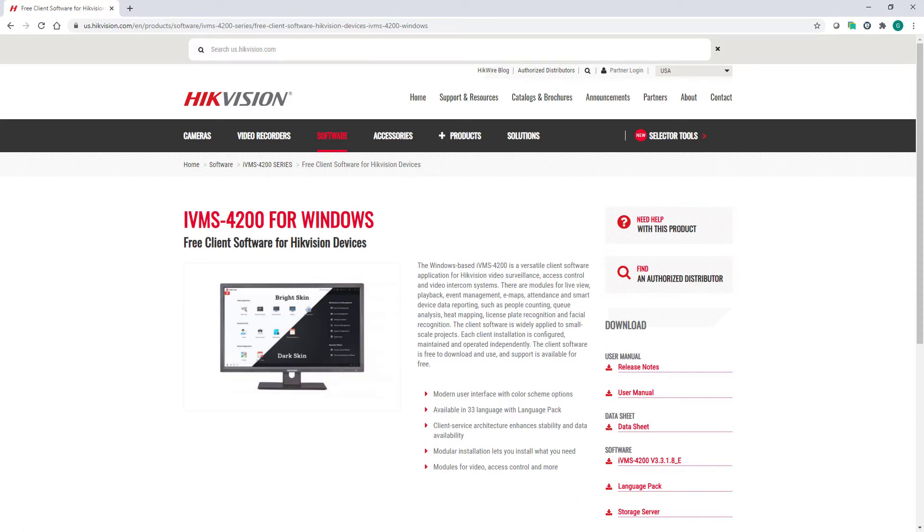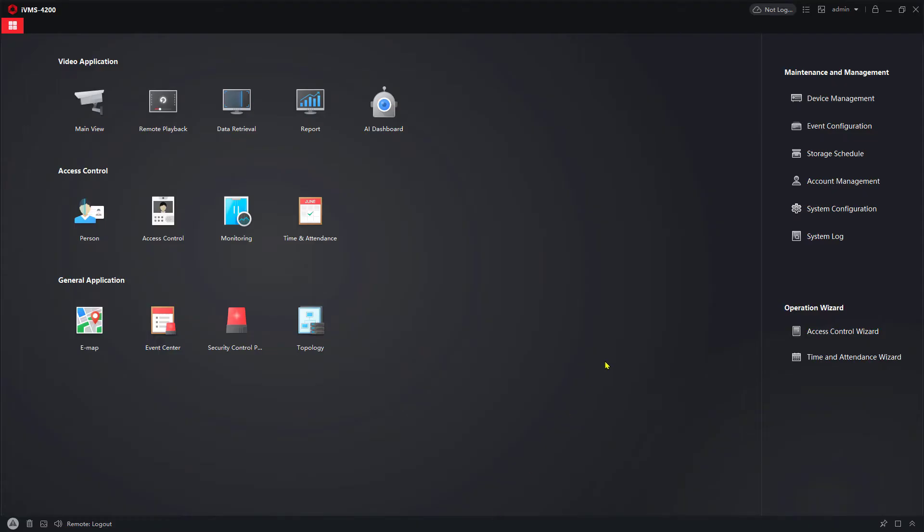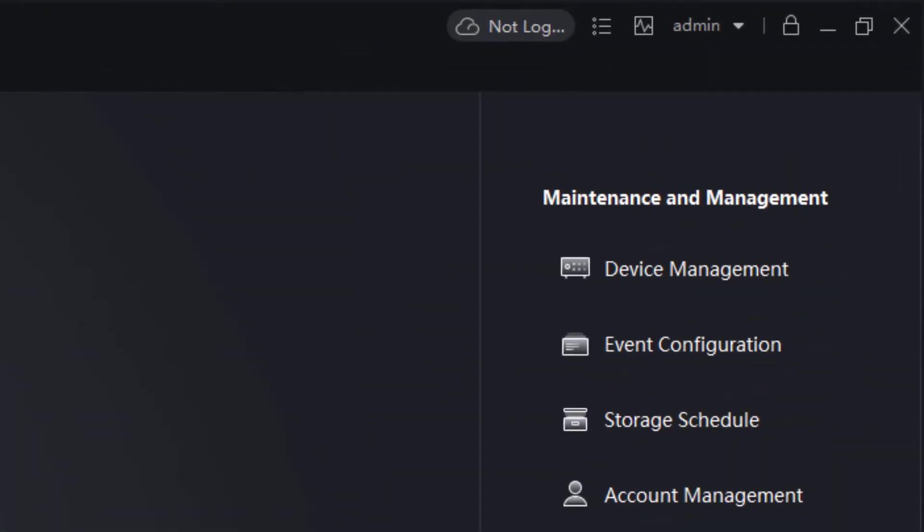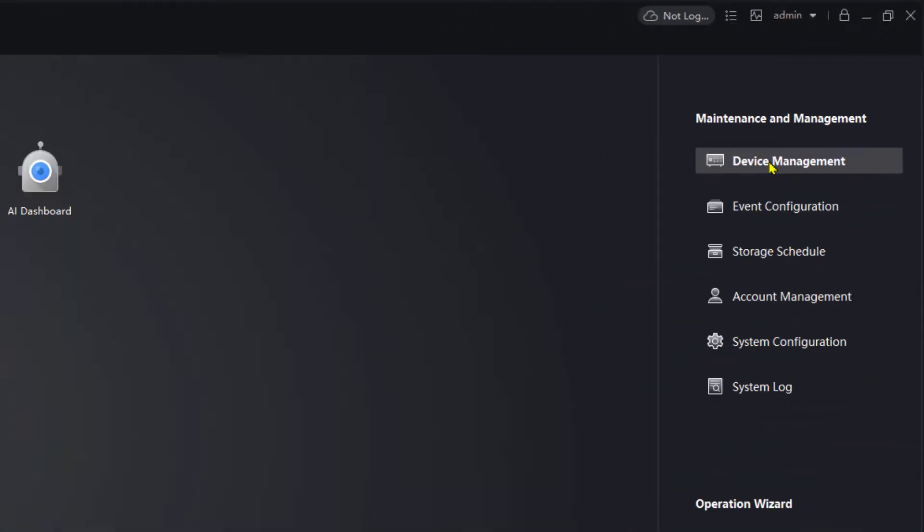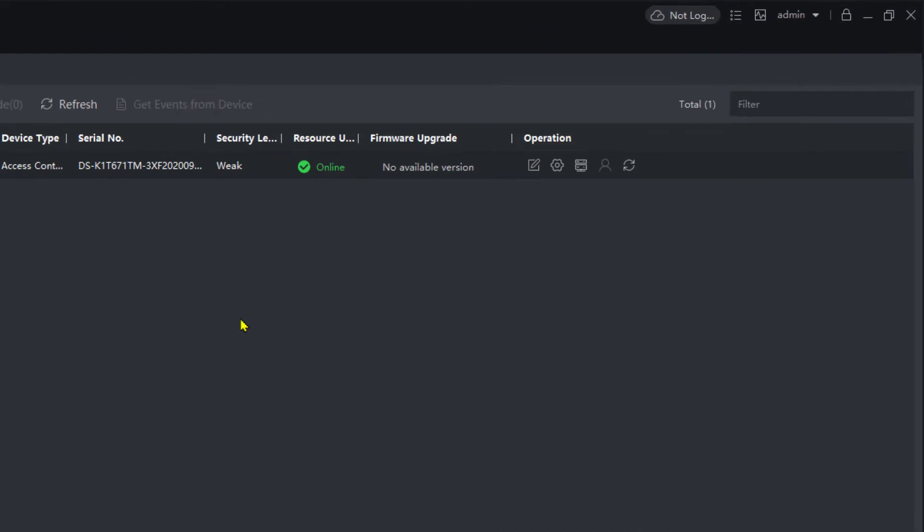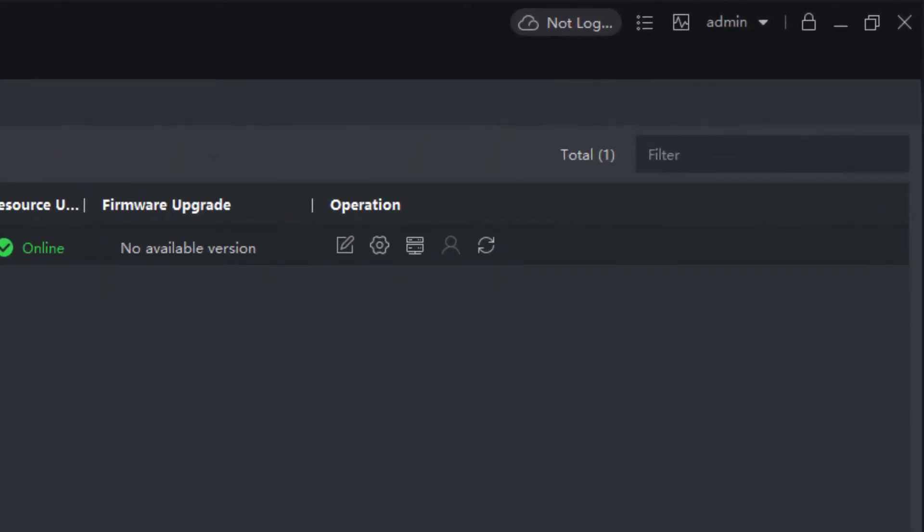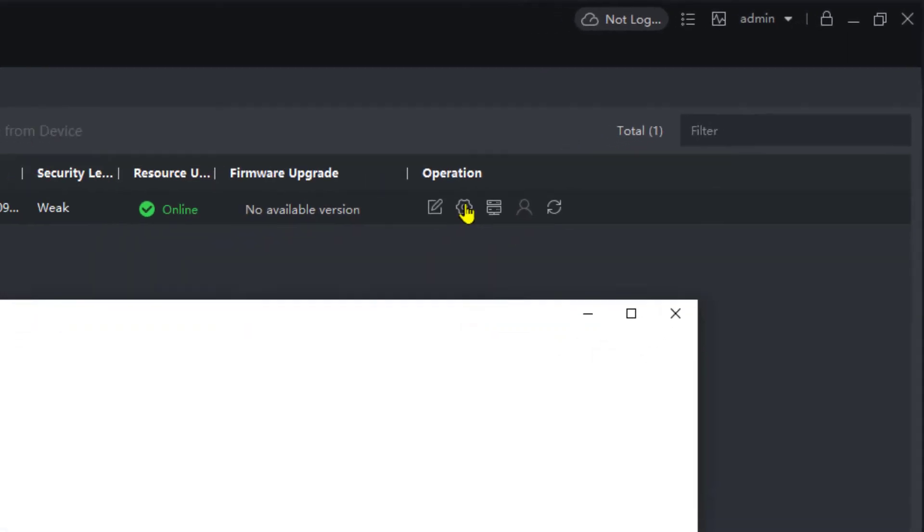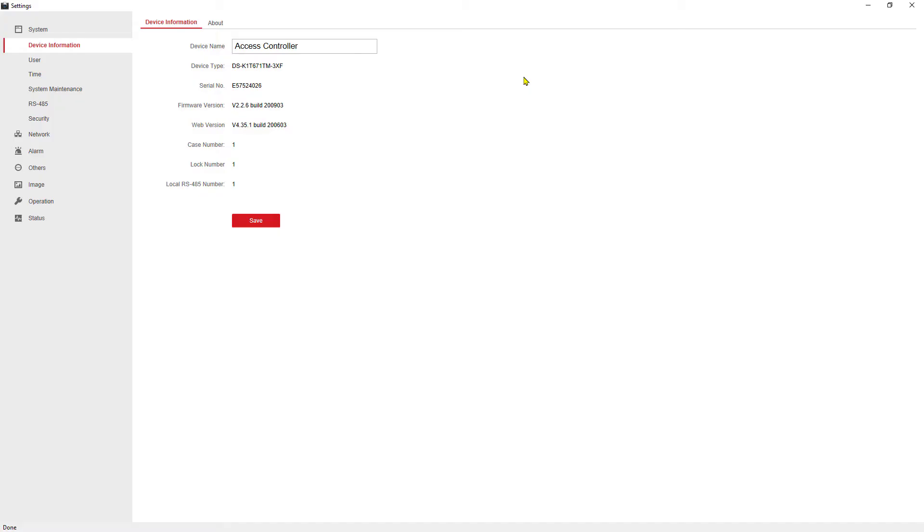So I'm going to go ahead and switch now over to the IVMS 4200 platform, and I'm going to go into device management. In this case, I've already added my temperature screening terminal device to my system, because what I want to focus on now as we said is upgrades.